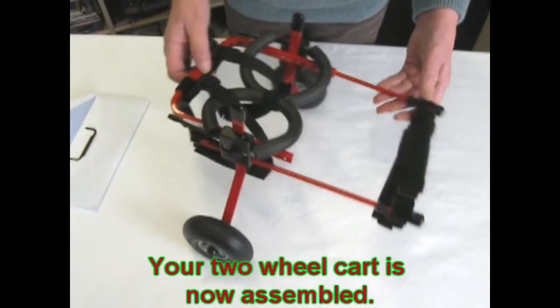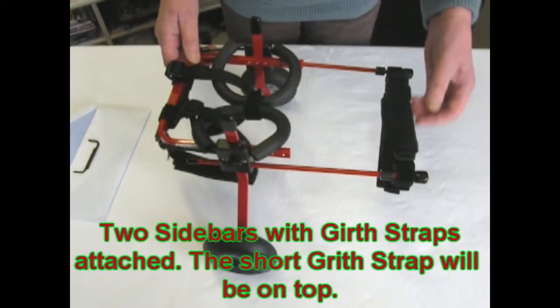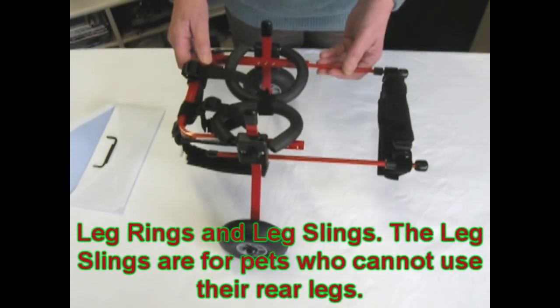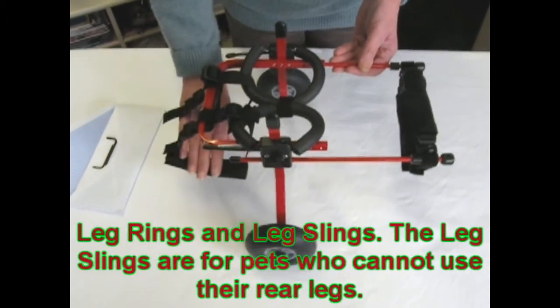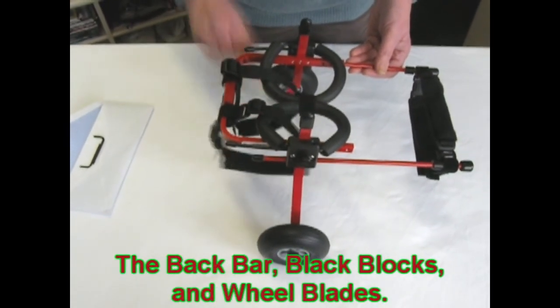Your cart is now assembled. Let's review: the side bars with the girth straps, with the short one on top; the supportive leg rings; the slings for your pet if they have no use of the rear legs; and the back bar holding your cart and wheelblades together.